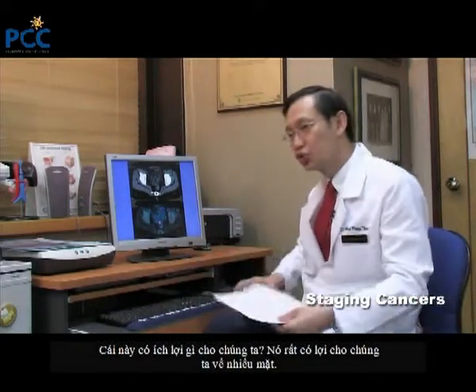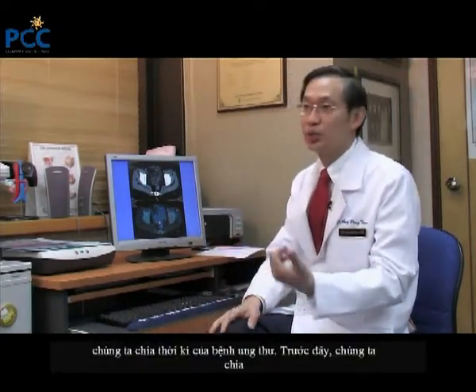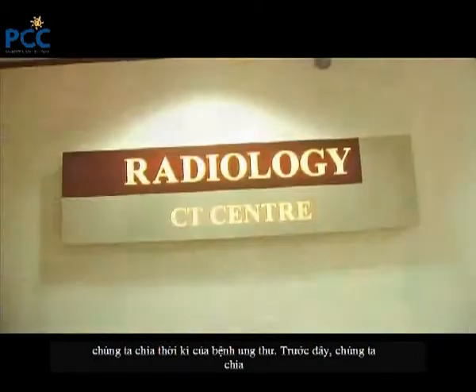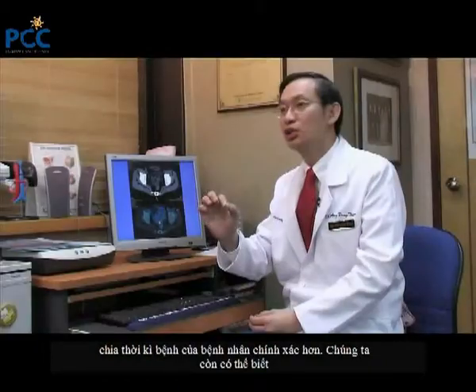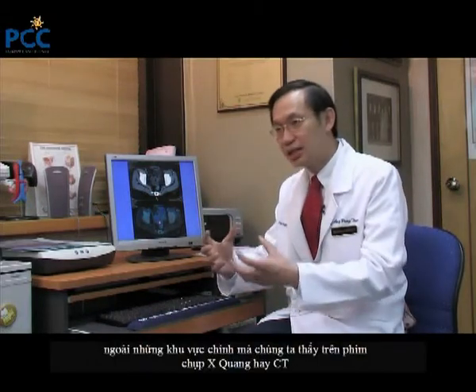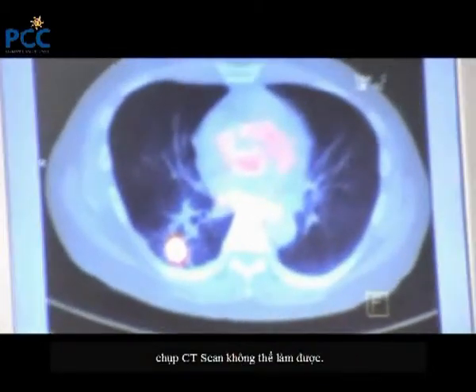How is this useful to us? This is useful to us in many ways. The PET scan has really revolutionized the way in which we stage cancers. In the past, we based the staging on X-rays, ultrasound, CT scan. But with a PET scan, we can actually stage a patient more accurately. We will be able to know, besides the main areas where we can see on an X-ray or on a CT scan, sometimes we can detect smaller areas which are not detectable on a CT scan.